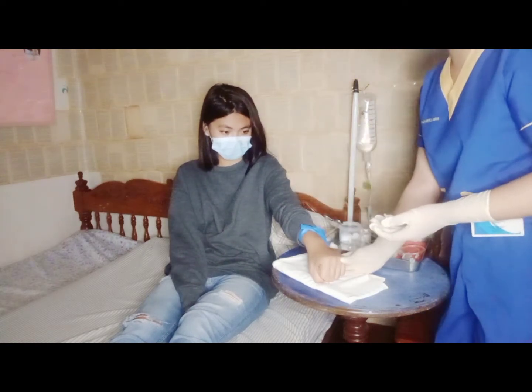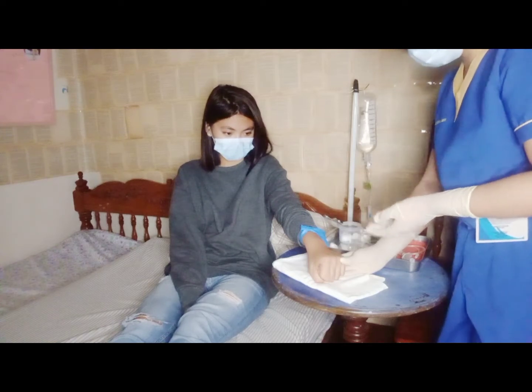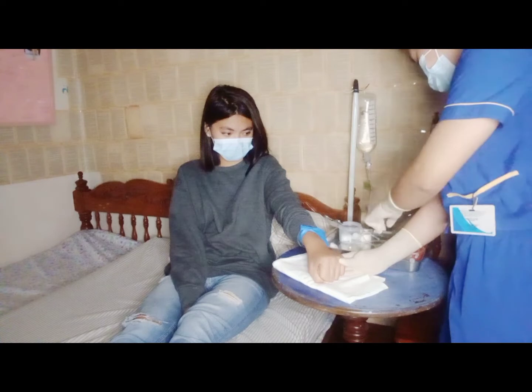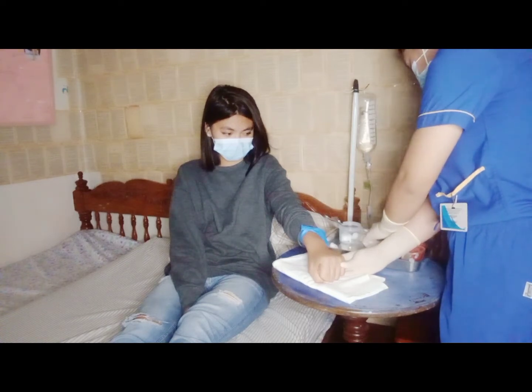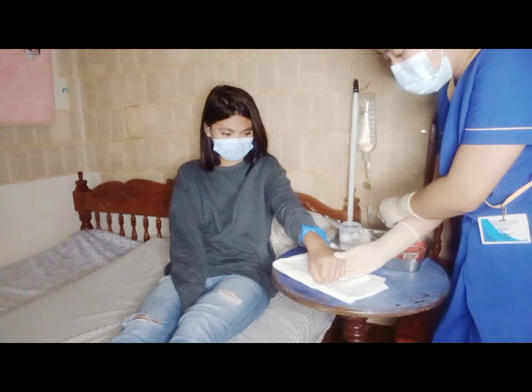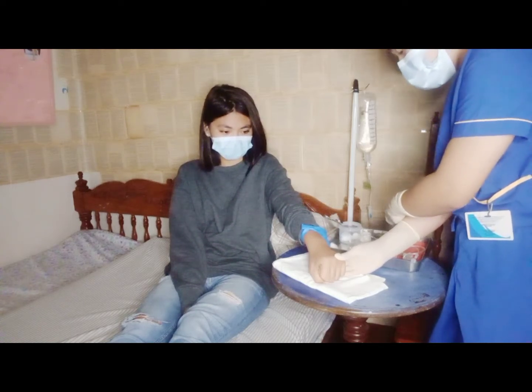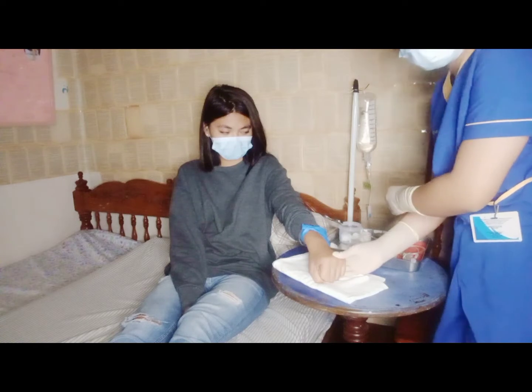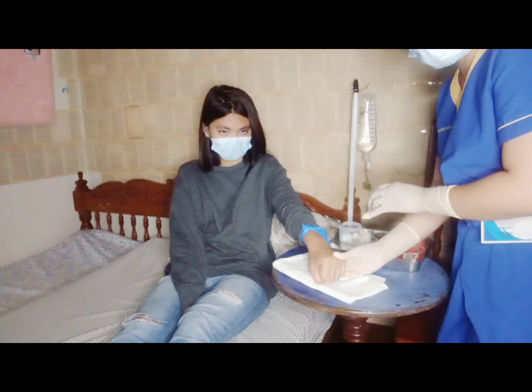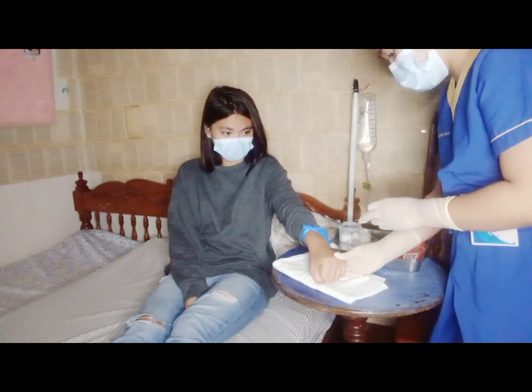Then allow the entry site to be dry completely. Then after that, we will hold the skin 1 to 2 inches below the entry site. Ayan. Para hindi lumihis yung ugat kapag tutusukan na natin ng catheter. Okay, so let's start.